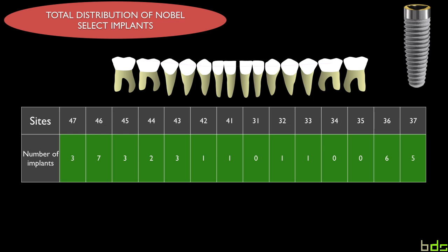What we did next was standardized X-rays, which I will show you later, where we measured on each implant the level of the bone from the marginal level, meaning the implant abutment interface, to the first peak of bone that we saw on the mesial and distal side.